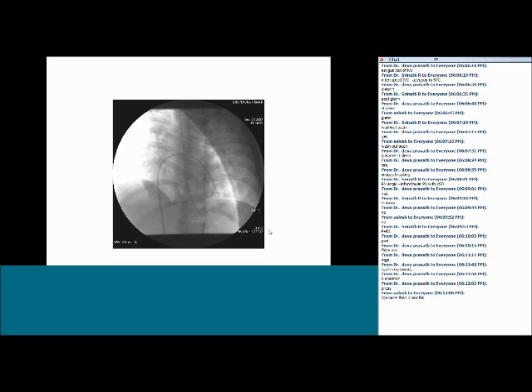Like this child, we had very good results by tearing the flap, and this particular catheter is via the PFO into the LV to check the LV pressure, whether the child still deserved an arterial switch or even a rapid two-stage switch. That was the purpose of taking the LV pressure. So this child was just more than a month old.